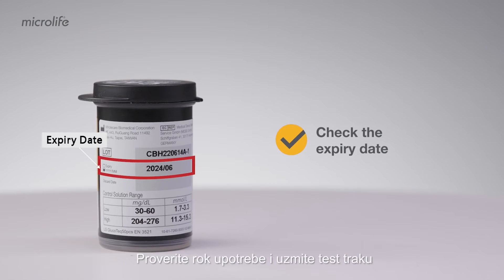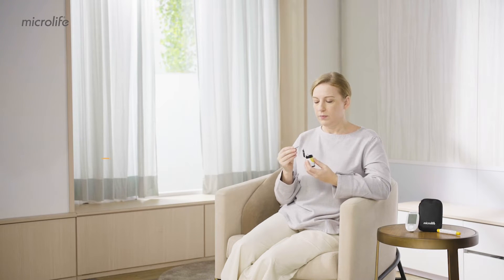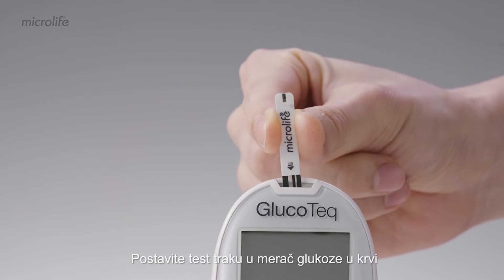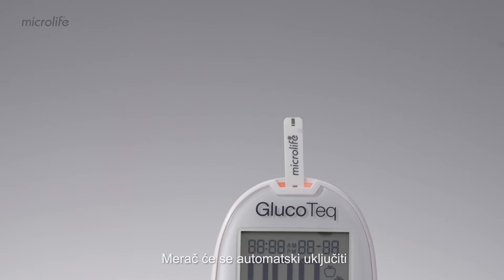Check the expiry date and take a test strip. Close the cap. Insert the test strip into the blood glucose meter. The meter will automatically switch on.